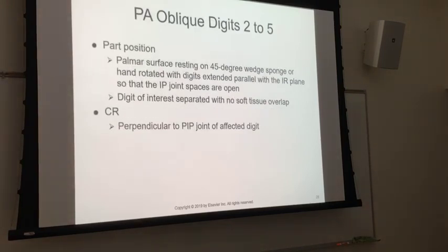Well, while we're on it, obliques. Sometimes your hospital will ask for oblique. And unless I point out otherwise, from here until the end of upper extremity and really the lower extremity, all your obliques are going to be 45 degrees. All your obliques are going to be 45 degrees.